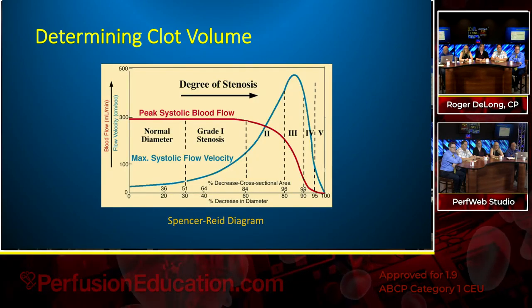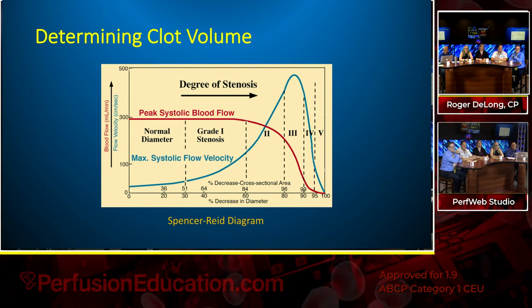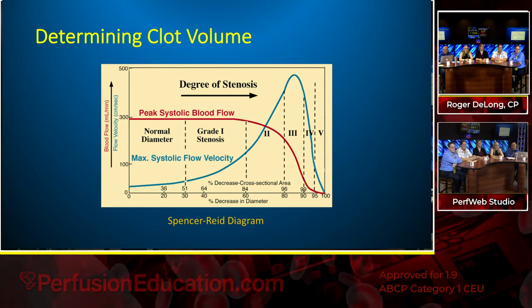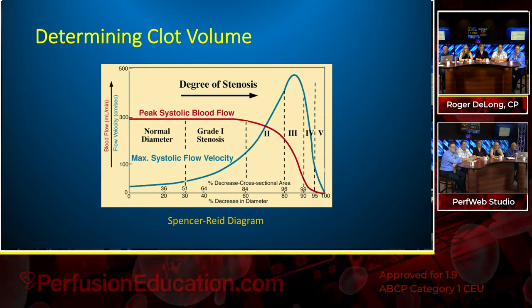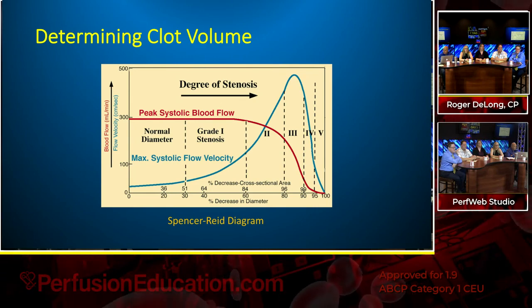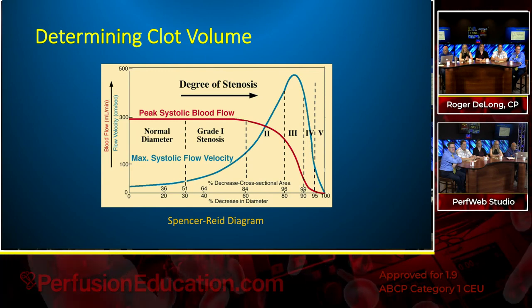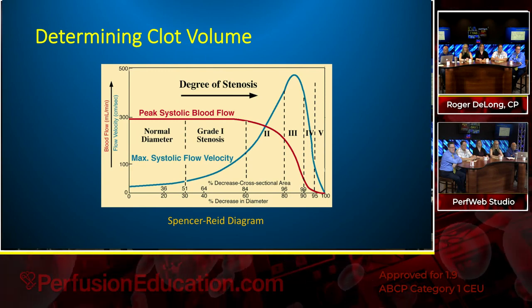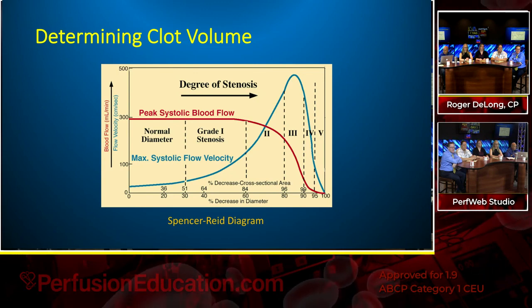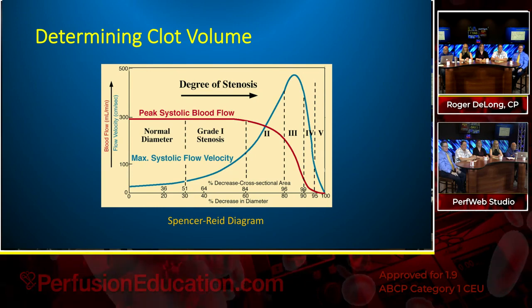All right, this is kind of easy to understand if you look at the basic pressure flow curves that we've seen. The red curve shows the amount of increasing blockage across the bottom from 0 to 100, and yet the red line will show you that the flow will remain fine up to about 70–75%. And that's not coincidentally why cath labs don't refer lesions for surgery until they're about that high, because you can sustain 100% flow through lesions that large.